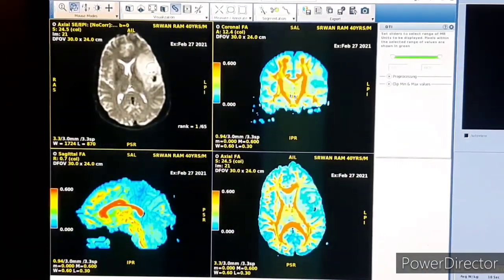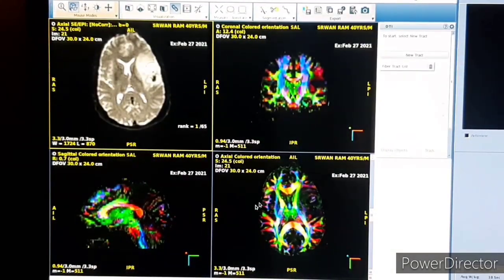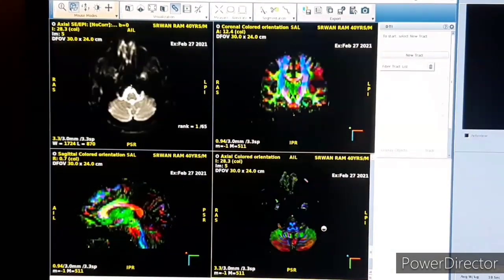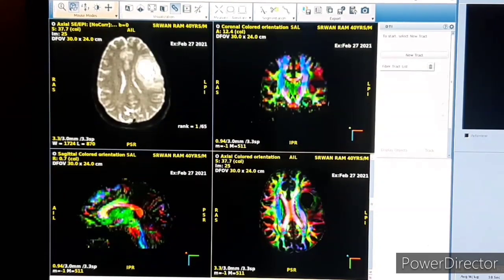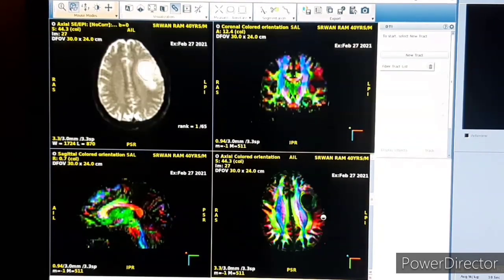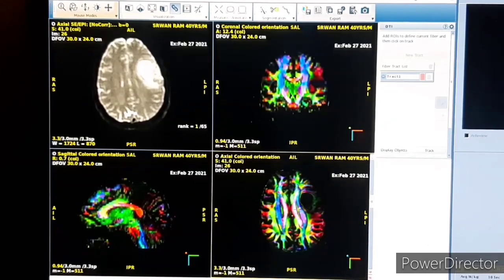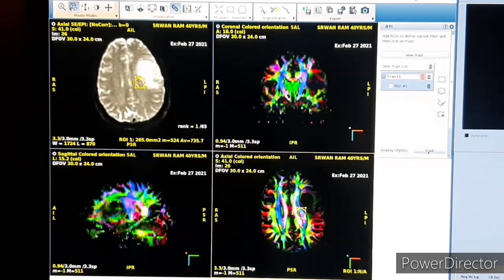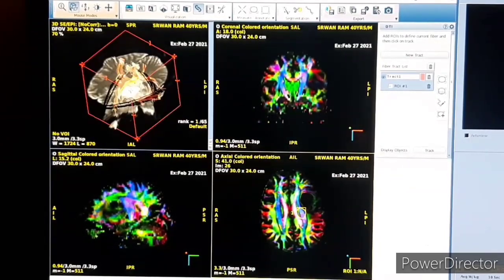Now we are going to the fiber tract option. There is an option called 'New Tract,' so we will select New Tract and we will track around the tumor area. You just drag, and we go to the tracks, so we will find the nerve fibers in the 3D view.